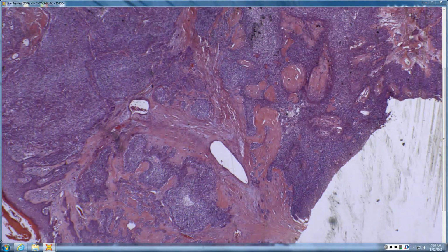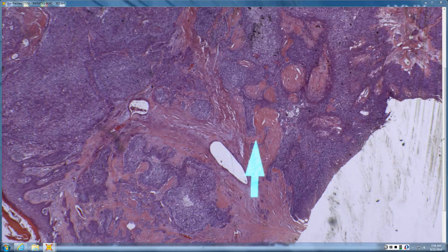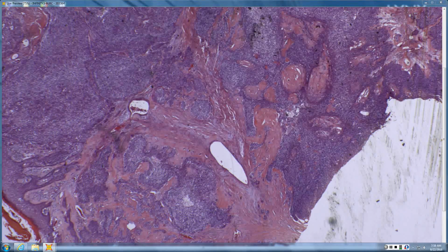poromostroma. So poromostroma is that red stroma. It's a million wraps of basement membrane zone around the vessels, causing this red osteoid-like stroma with tiny little blood vessels embedded in it. It is absolutely characteristic of the poroma group, but as you pointed out, poromas tend to be red. This one is bluish because there's so many nuclei, so this is probably poroma gone bad, or porocarcinoma, malignant acrospiroma.